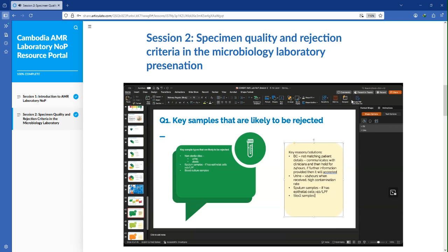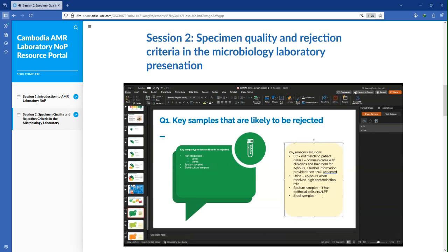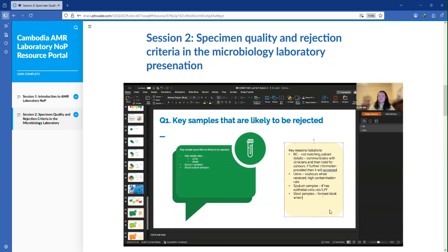My laboratory only receives stool culture, and I do reject some. But it's not only rejection, because in one month we receive only one stool sample. What I reject for stool culture is that we culture only diarrhea, but when the clinician cultures the stool, mostly the stool is not diarrhea, it is hard.